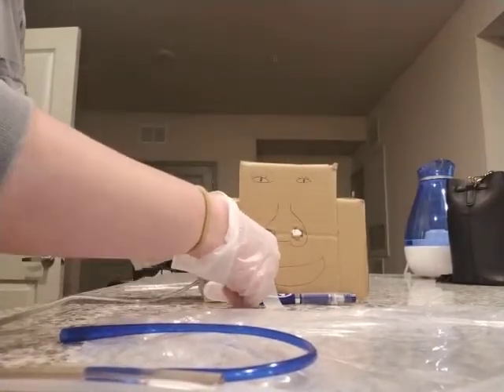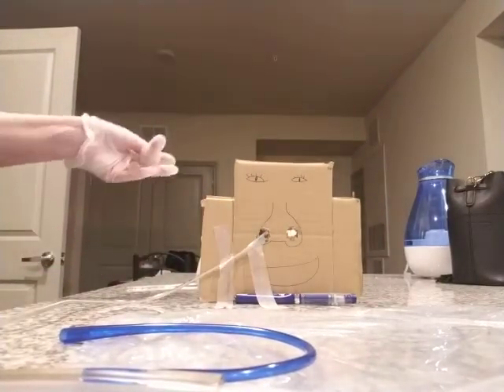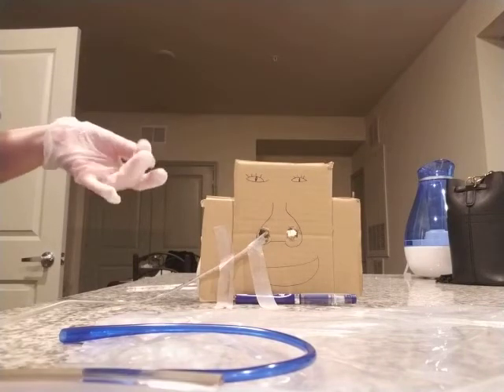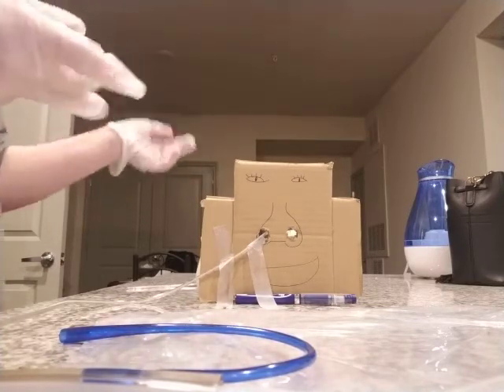Temporarily tape this to the client's cheek. Okay. I'm going to check the placement of the tube. I'm going to ask the client to speak, see if they're able to speak, and inspect the posterior pharynx for presence of the coiled tube.